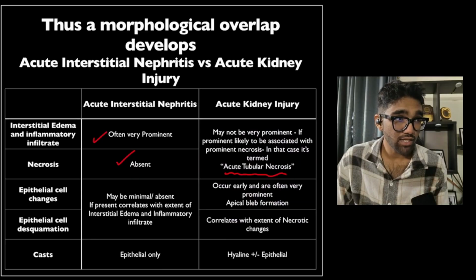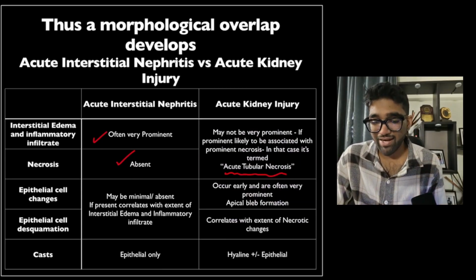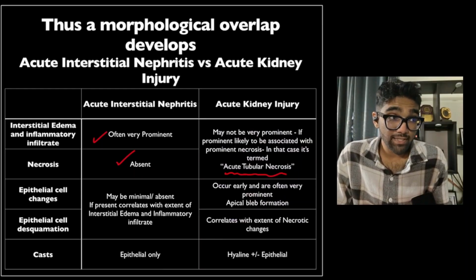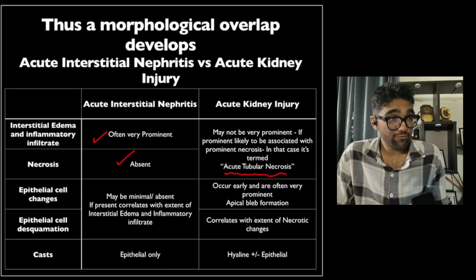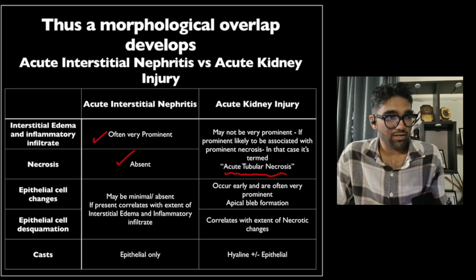in clinical practice. Again, people go a step further and say acute cortical necrosis, and that to me is absurd. But okay, so there is no clinical avenue for the diagnosis of acute tubular necrosis or acute cortical necrosis in the absence of histopathology. So, essentially, if you label it as such, you obviate the need for further histopathological analysis. So, you essentially shut down the conversation. So, I would not suggest that you go down that line.